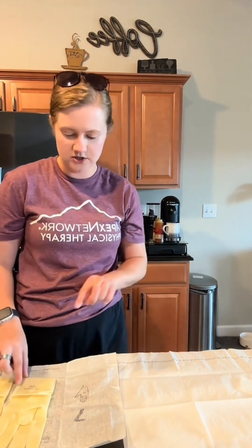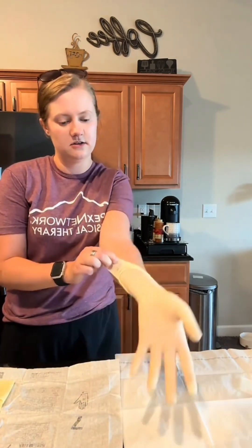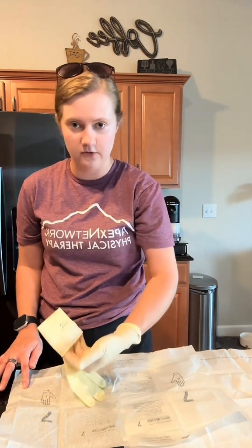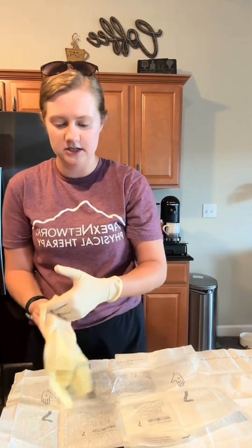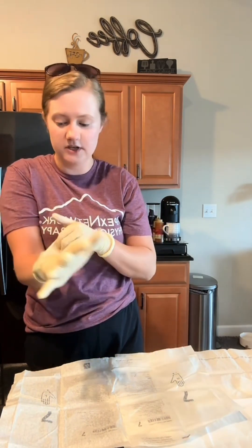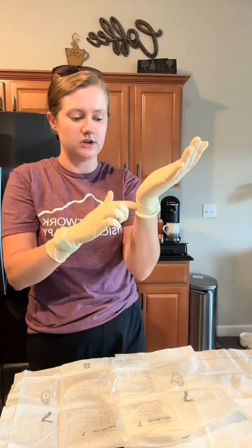I'm going to grab my dominant hand first. This is rolled up so this is going to be what's against my skin anyway, so I can just grab it and slide my hand in. This hand is now sterile. To grab my other glove, I'm going to move this over — I have to reach under the little fold here, as you can see — and then I can slide my non-dominant hand in. I won't have a watch or ring on for my demo because I don't need any extra barriers when I'm already super nervous.